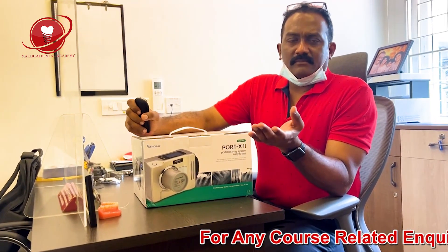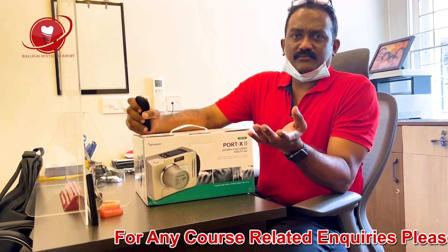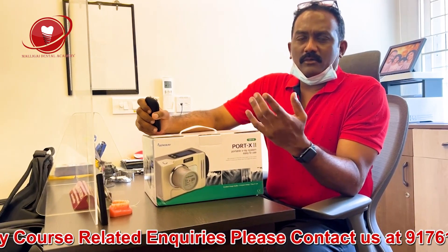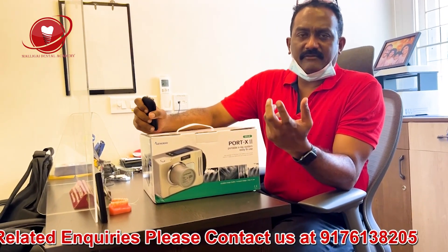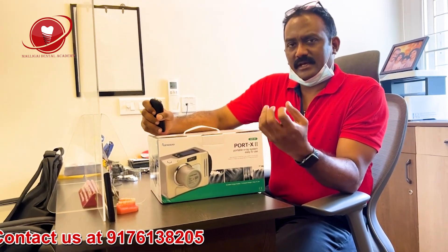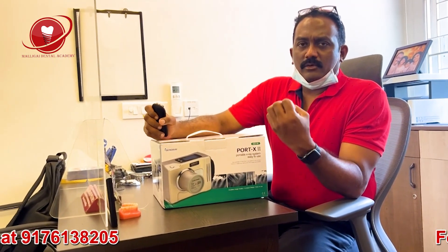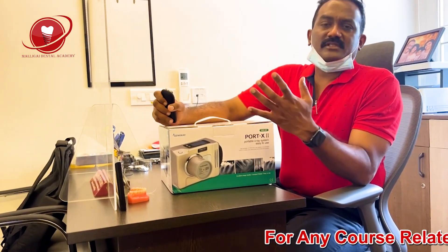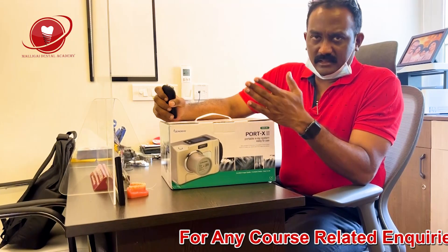I have been practicing implants for the last almost 12 years and practicing dentistry for the last 22 years, so I know how difficult it is to take an X-ray every time. The patient positioning, the sensor positioning, or the X-ray film positioning — everything goes wrong when you don't keep it properly. One thing I invested in early in my practice is a portable X-ray machine.